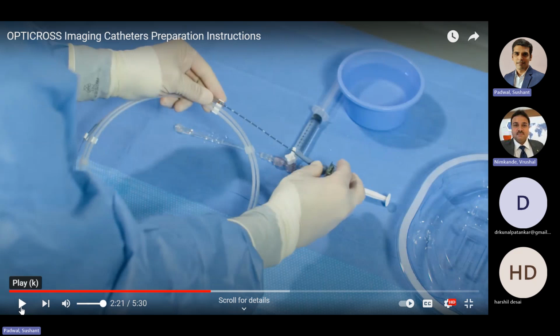That will be the exact focal length, and the same will match with your long view also, if you want to confirm it on IVUS. The only thing is that when you do a manual pullback without connecting the MDU on the sled, you will not get the long view image. You will get only the cross-sectional image. The long view image comes only when you do an automatic pullback. Clear? Okay.